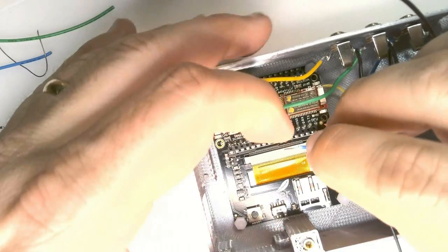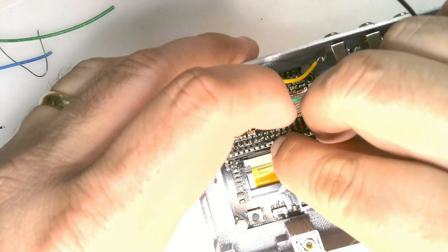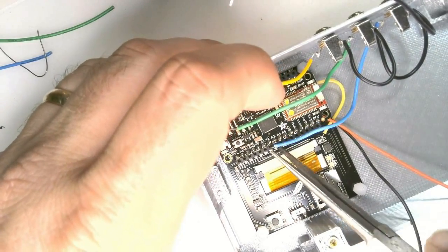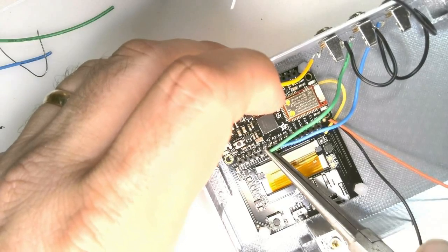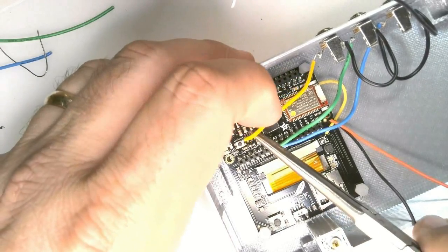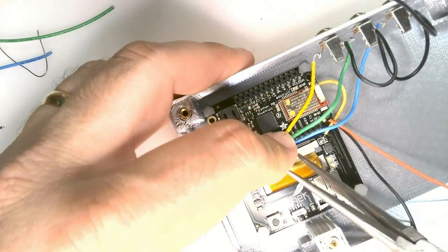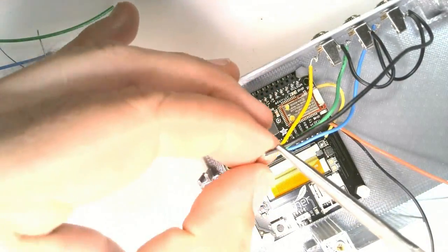Start with the signal wire from the furthest jack right and plug it into the A2 pin. Then take the signal wire from the center jack and plug it into A1. It's easier to do it if you use a pair of needle nose pliers to firmly insert the wire into the jack. Finally, the left jack goes into pin A0, and the black wire goes into the ground pin, which is adjacent to those 3.